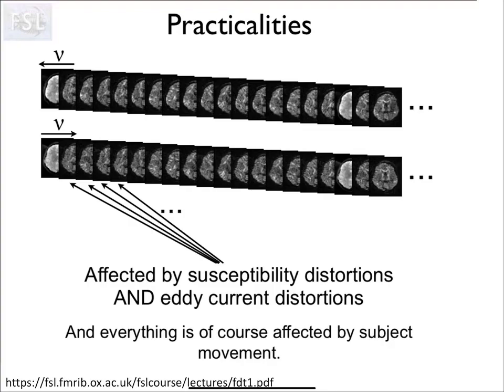So anything you can do to get rid of these also helps, because these all tend to smear things out as well, right? Because you're never going to be able to perfectly fix all those things. And so part of high resolution, high fidelity diffusion imaging is trying to solve these problems so that you're not ending up with this big blurry voxel that has lots of stuff in it. Okay. All right. Any other questions?